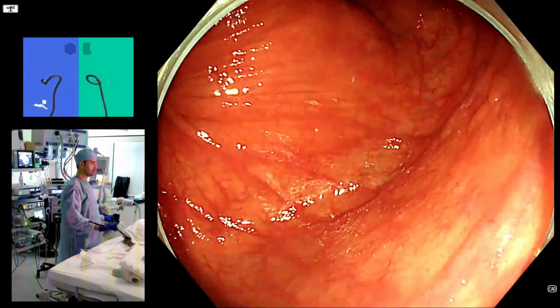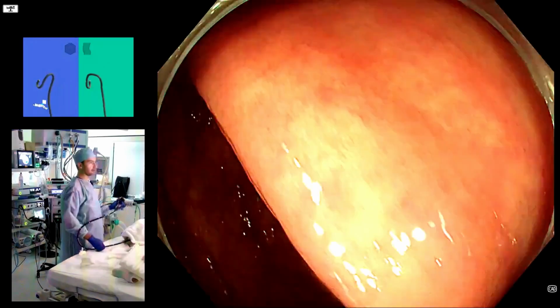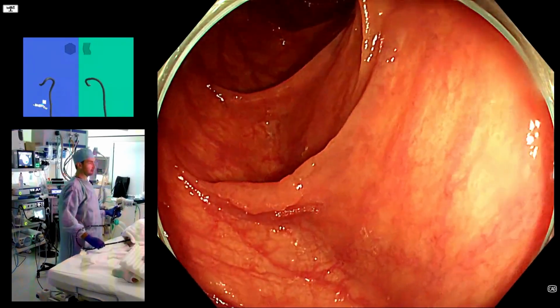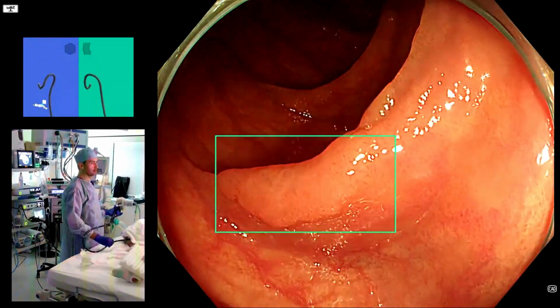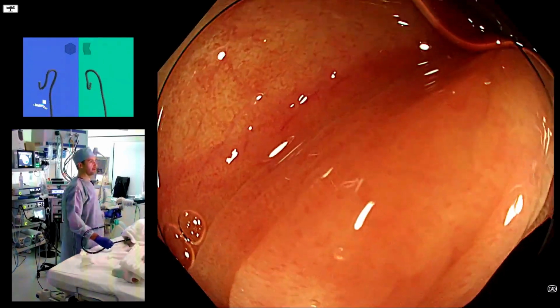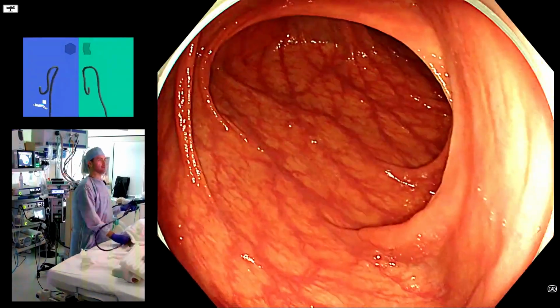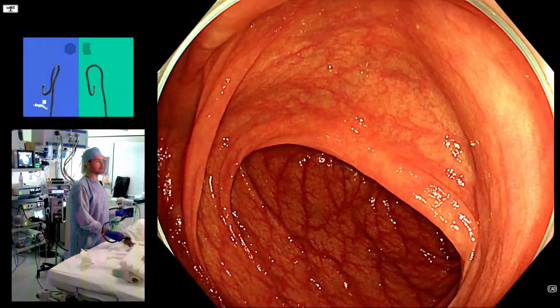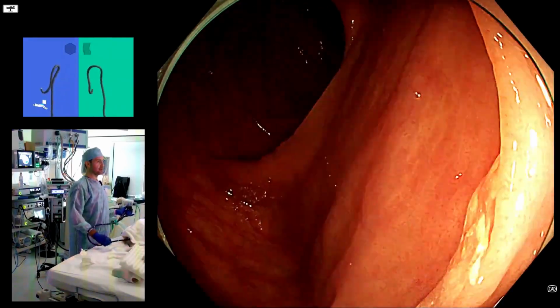But here we're just on the hepatic flexure probably. Another little polyp there. For sure it's another little polyp as the retroflexion comes off. So then just still on, so we definitely didn't see that before. Like a non-granular type thing, just sitting on a fold there as we pulled back without insufflation. And of course, you may say, well, I had the AI on, so surely I was going to detect all of these polyps, but we didn't detect them simply because I didn't use the cap properly and I didn't have enough distension.